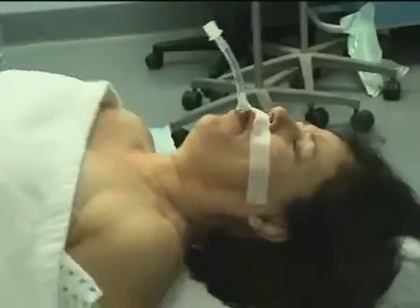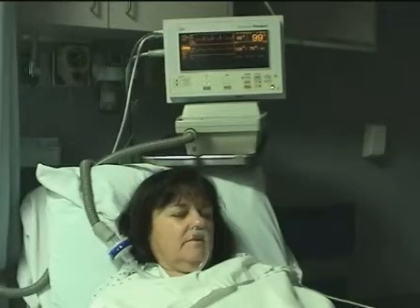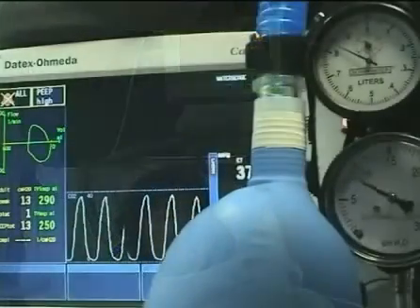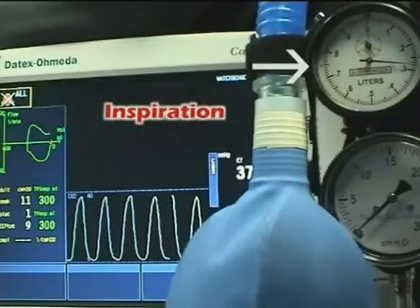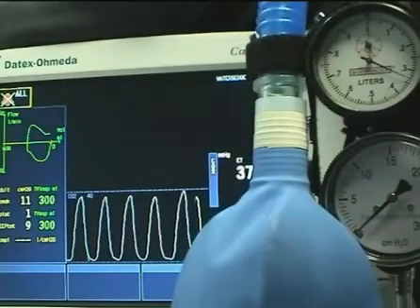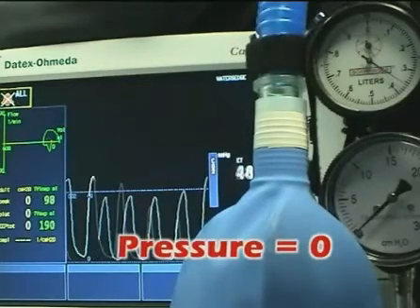The need for a better way to support oxygenation and ventilation during fiber optic endoscopy, the need for a better way to monitor the respirations of high-risk MAC patients and to avoid the fire hazard of the oxygen-enriched environment that accompanies oxygen cannulas, the need to extubate the patient smoothly without bucking and coughing, and the need to prevent atelectasis in the immediate post-anesthesia period. In conclusion, an added degree of vigilance is required to use nasal CPAP in anesthesia practice. Nevertheless, the experienced anesthesiologist will find an area of his practice where nasal CPAP is a worthwhile alternative approach to airway management.